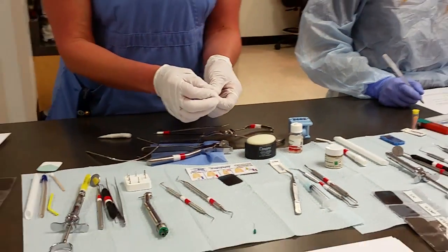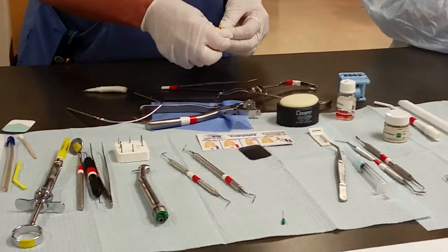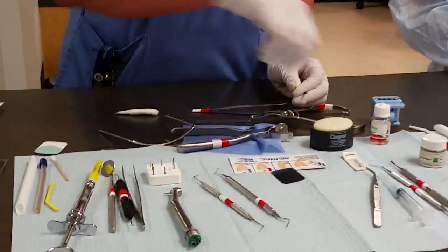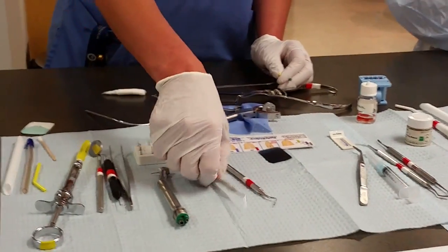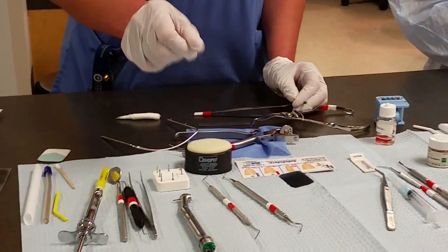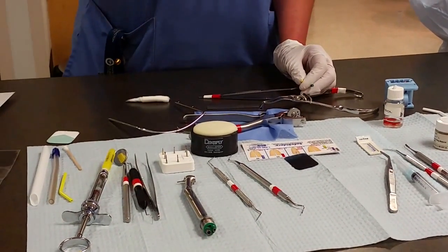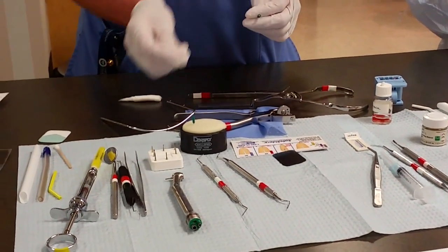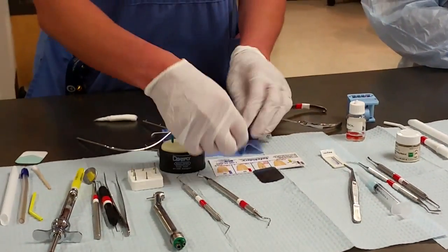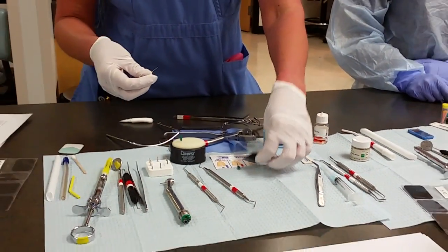The barbed broach — the green one — is used when we locate the canal to get the nerve out. The nerve, when you pull it out, looks like spaghetti. We grab the nerve and just pull it out with the barbed broach. After we pull the nerve out, we go in and start filing the canal — filing and smoothing in different sizes. After smoothing it a little, we take an x-ray to find out the canal size.